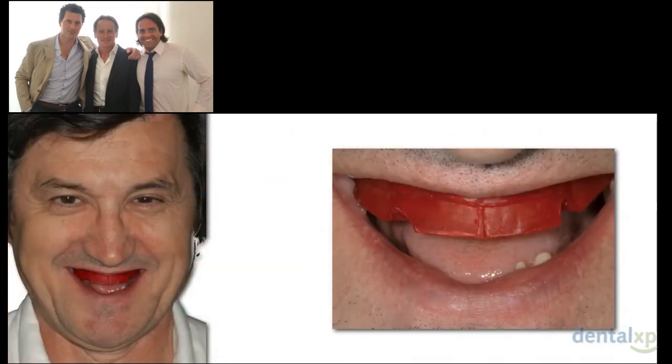We are gonna take this wax up, and we're gonna give to Luca aesthetic information, prosthetic information.